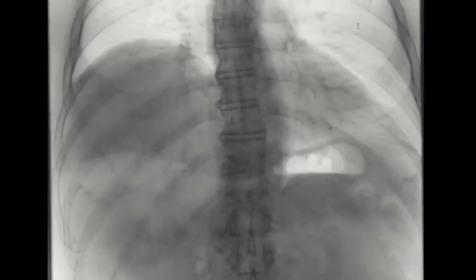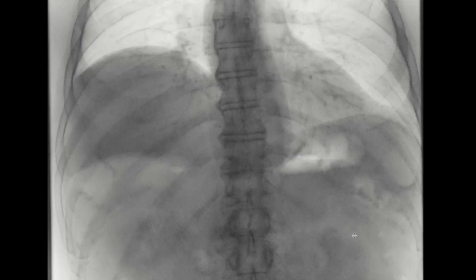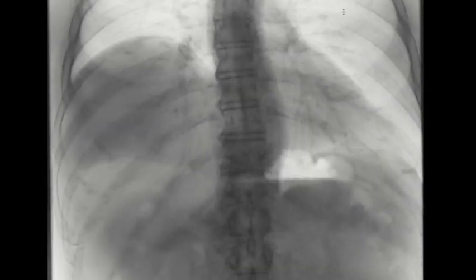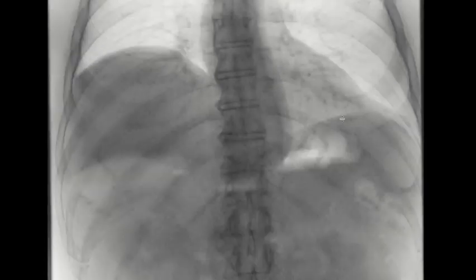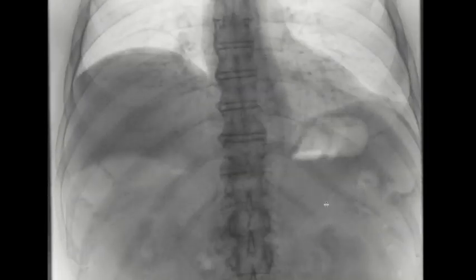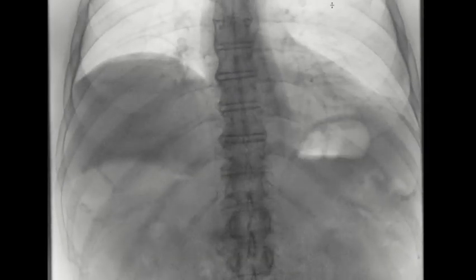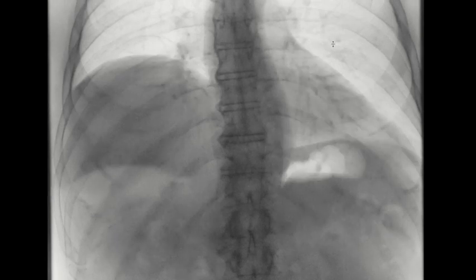As I scroll through you can see the left hemidiaphragm moving up and down, and there's a marked difference between the two. This is a patient with right hemidiaphragmatic paralysis of uncertain etiology — a patient referred from the pulmonology clinic. Notice how the left hemidiaphragm comes down with inspiration, then rises with expiration.